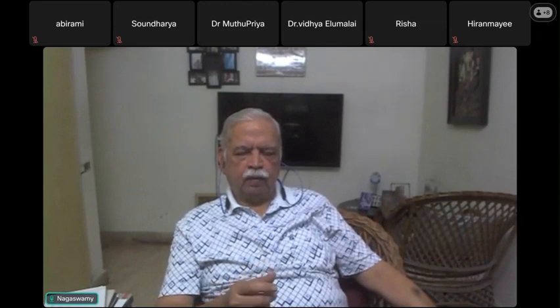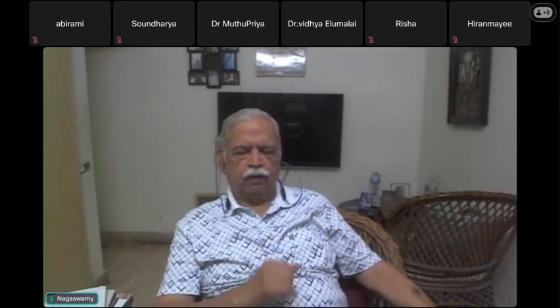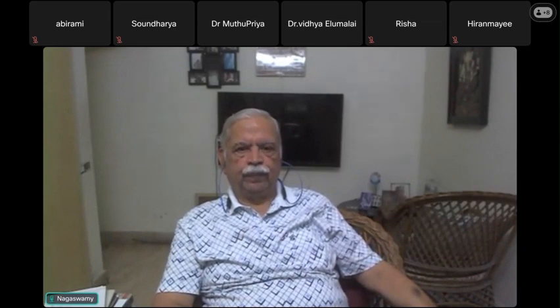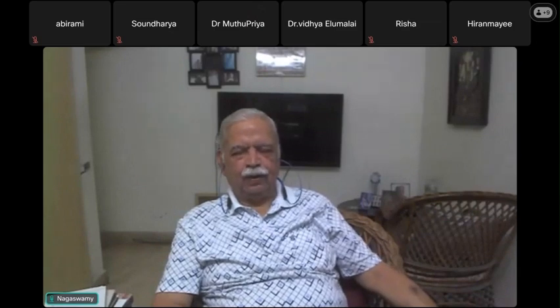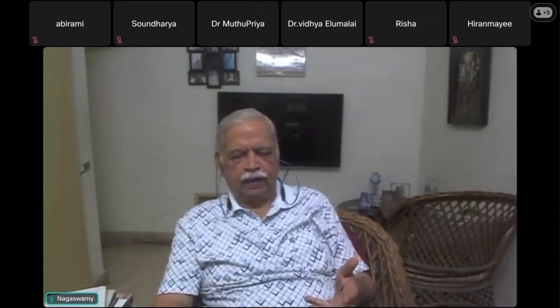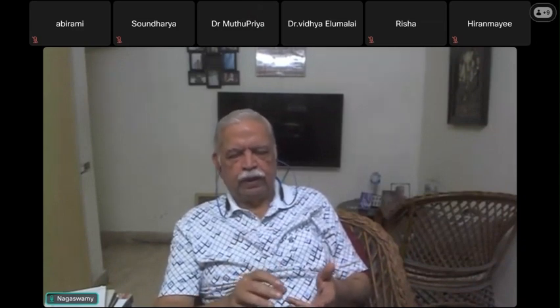The second problem is you try to push, it goes into the esophagus instead of the glottis. Then what will you do? Head position. Yes, you have to flex the head. So you lift the head at the occiput and flex the neck of the patient, withdrawing the tube from the esophagus, and then push it, then it will go.